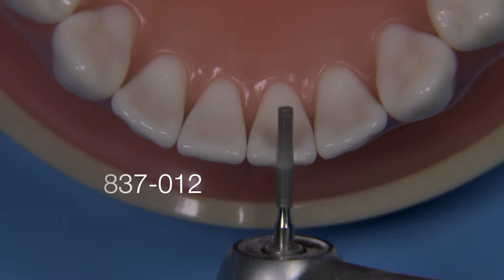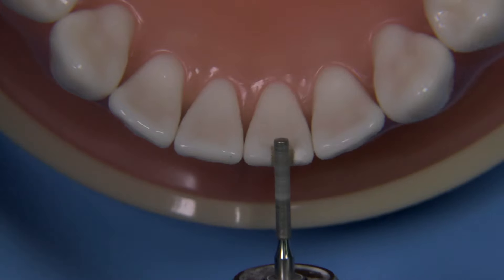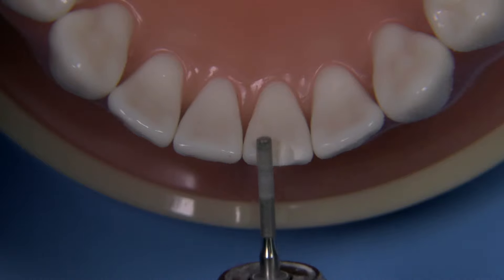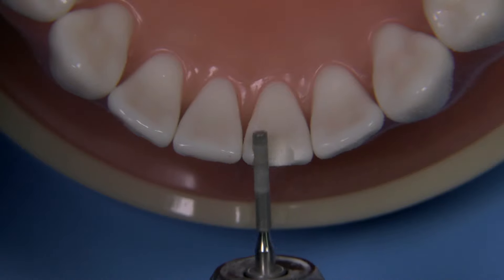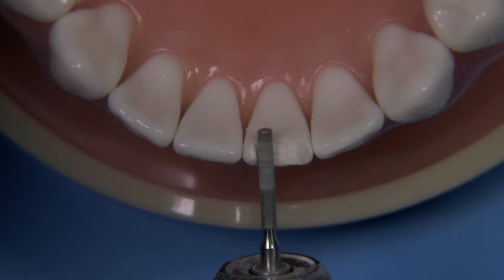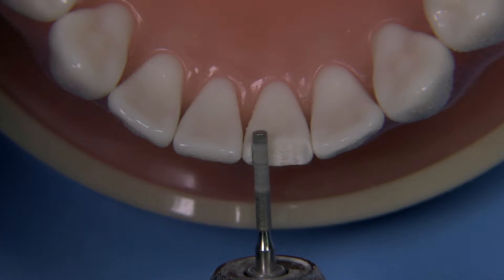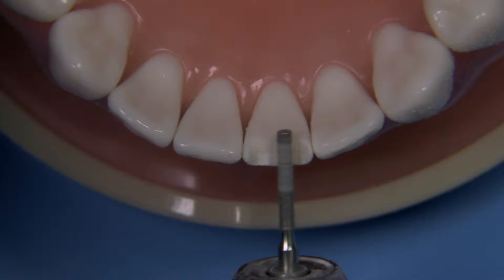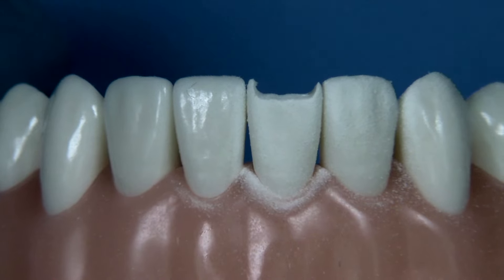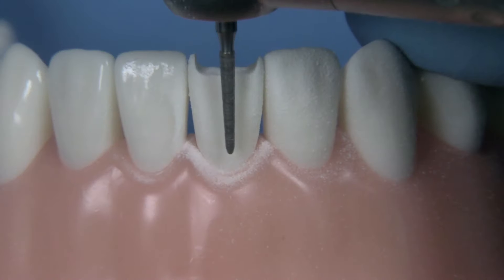This is an 837-012. Now this burr is cylindrical and it's also 100-micron grit diamond, so it works pretty efficiently. We're going to be reducing today just a little bit more than the diameter of this burr, which is 1.2mm — we're going to go all the way to 1.5mm. Now if you needed additional incisal translucency, perhaps a patient required that kind of translucency, we would want to reduce perhaps even as much as two millimeters.